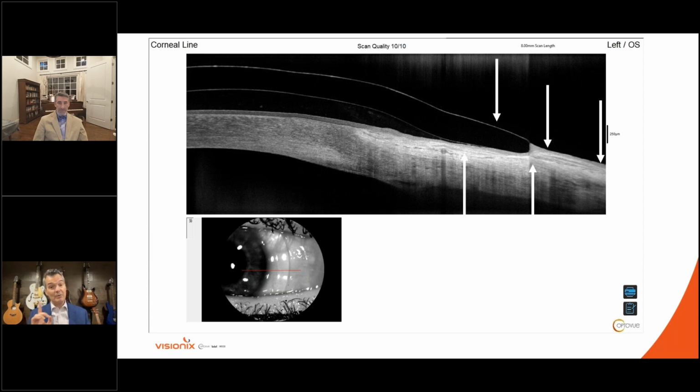One of the things we do want to pay attention to is where I put the second arrow. As we go back into the landing zone, the more proximal portions, not the distal portions on the right-hand side of the screen, you can see how the toe, which is the most distal portion, is subtly resting more weight on itself than the heel, the more proximal portion.